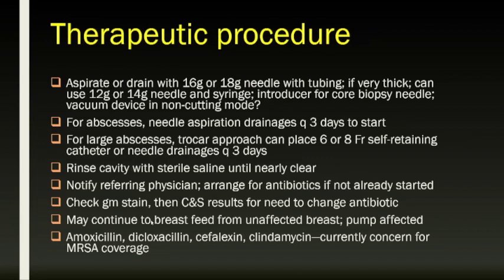And once you've emptied the cavity, you can rinse it with sterile saline until the saline returns fairly clear. It takes quite a long time to empty some of these abscesses, as I'm sure some of you know. Then, when you finish the procedure, notify the referring physician and arrange for antibiotics if not already started. Check gram stain and culture to see if there's need to change the initial antibiotic given to the patient.